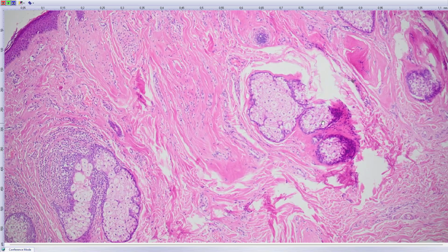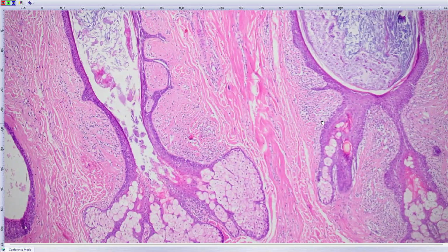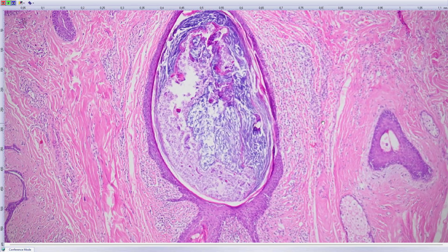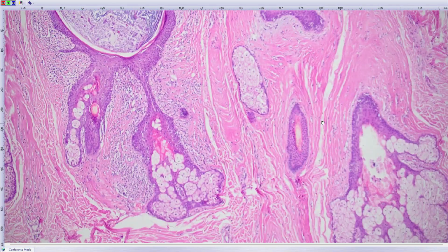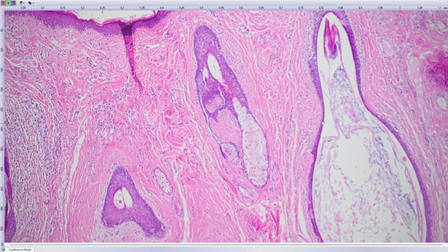And you see it's associated with hyperplasia of sebaceous glands. And there is a proliferation of stroma as well, but the stroma is centered on these sebaceous glands. I showed you several cases in previous seminars which look very similar, but are entirely different.